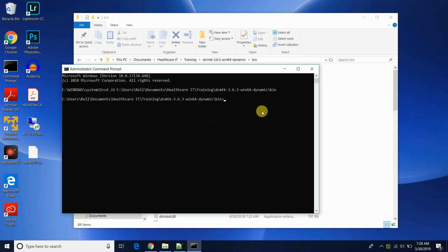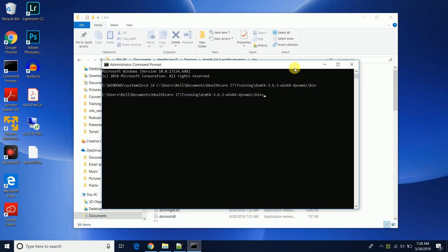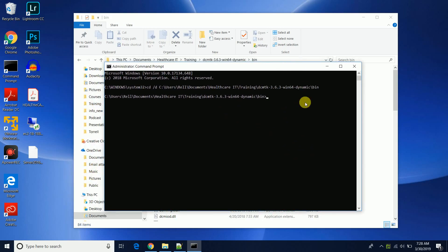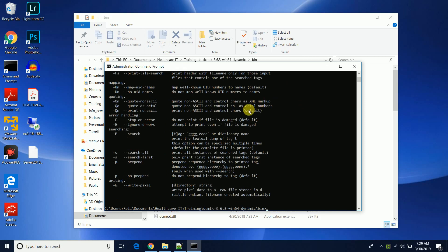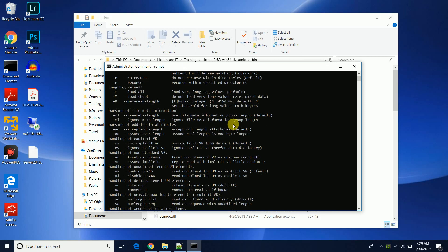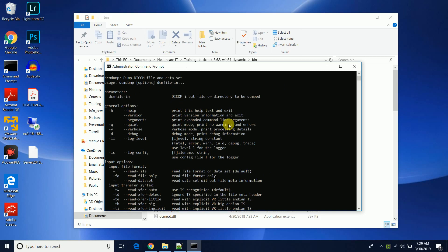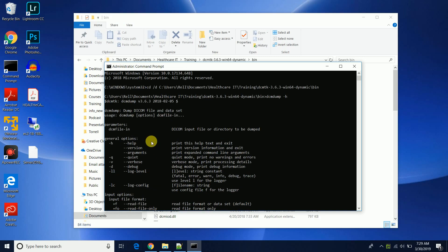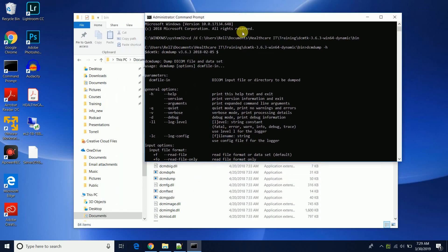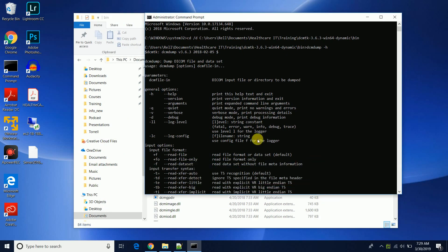Now we're gonna just run our DICOM dump test. So we're gonna do DCM dump and if you wanted to also display what parameters and options you have for DCM dump or any application in the DICOM toolkit, you can do dash dash H and it gives you all of your options and parameters that you have available.